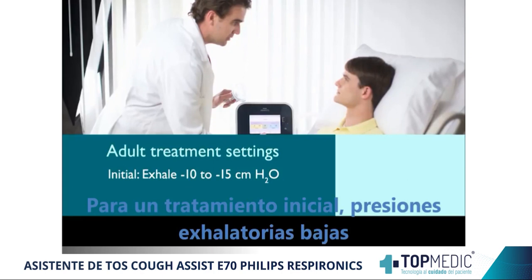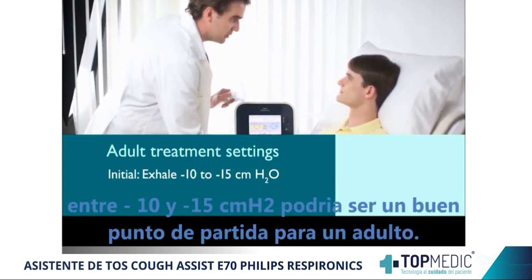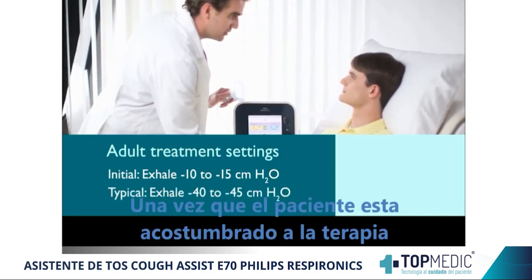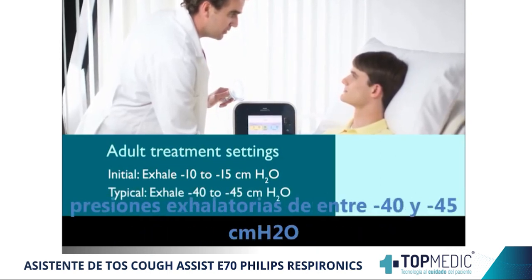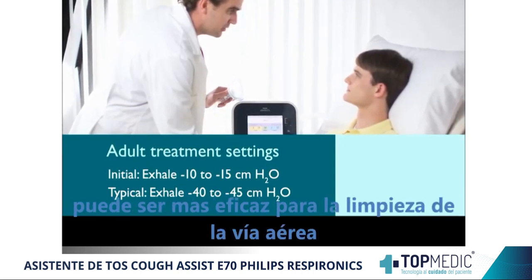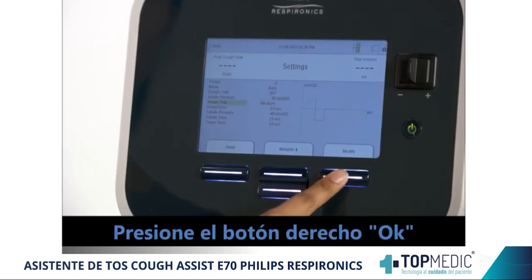For an initial treatment, a low exhale pressure of -10 to -15 cm H2O may be a good starting point for an adult. Once the patient is accustomed to the therapy, exhale pressures of -40 to -45 cm H2O may prove more effective at clearing the airway. Press the right button under OK.